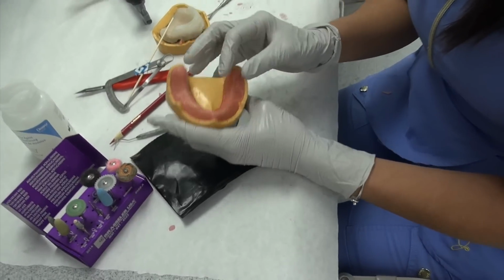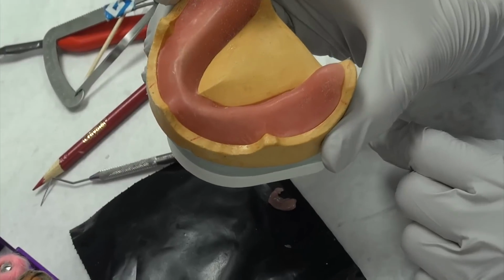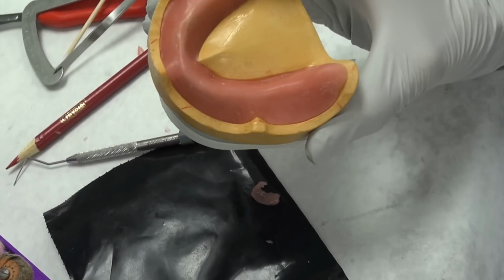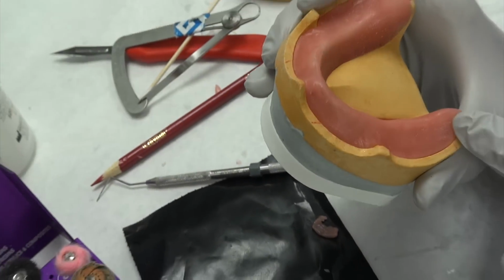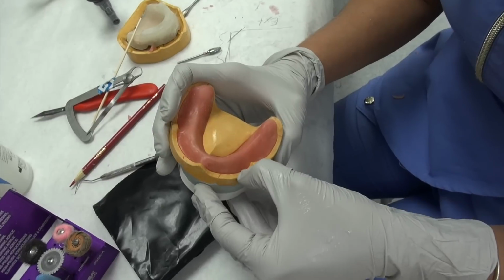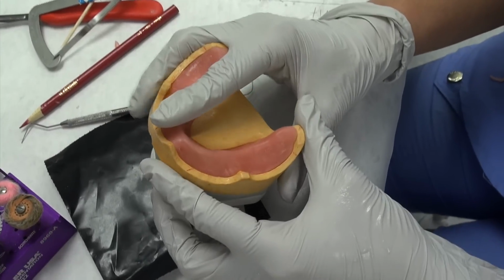Okay, now if we come over here, we can see how it's just slightly thinned. And there's a little room for the frenula movement when you have the record base in the patient's mouth. And see how smooth the edges are, and they still come right up to the peripheral. Right up to the peripheral. Okay.